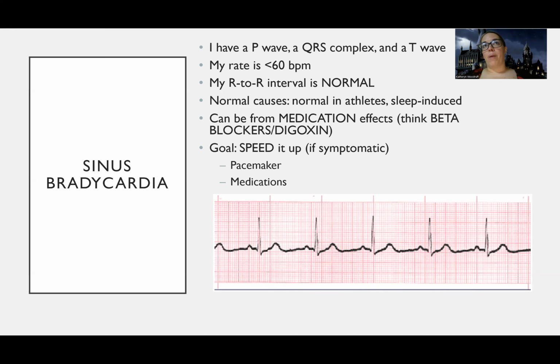So you always have to look at the patient's stability when it comes to sinus rhythms like sinus bradycardia or sinus tachycardia. How are they tolerating it? Maybe their heart rate's 57, their blood pressure's fine, they're doing just all right. Maybe their heart rate is 52 and they're not doing so hot. Their blood pressure's low, they're diaphoretic, feeling a little dizzy. We'll talk about this later, but with all rhythms, especially ones that can be stable or unstable, you always want to look at how the patient is doing. How are they feeling? Do they have any symptoms? What's their blood pressure? How are they oxygenating?